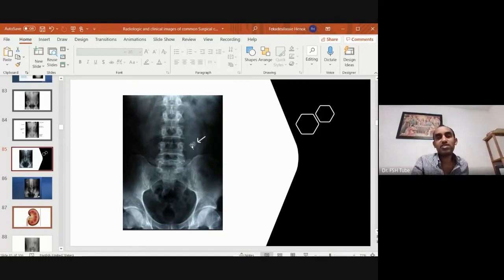What we can see is there is an abnormal radiopaque shadow, right? That's how you describe it. So when you describe it, okay, I see this is a KUB of a patient, and I see some abnormal radiopaque shadow. Differential diagnosis, most probably it's a ureteric stone because it is in the ureteric projection. But differential includes, it could be a fecalith, it could be a retained foreign body like a bullet, it could be a swallowed foreign body which is descending down.